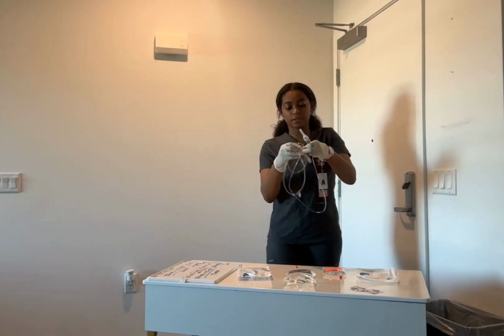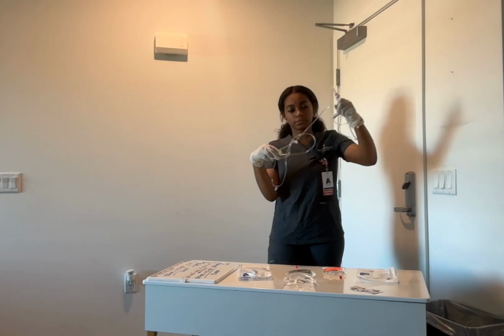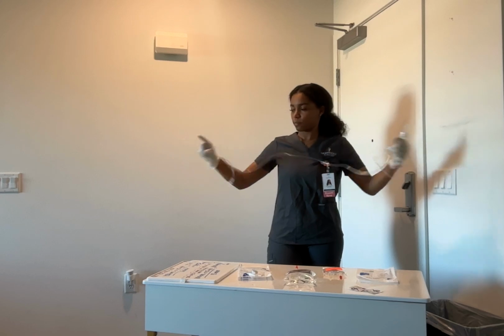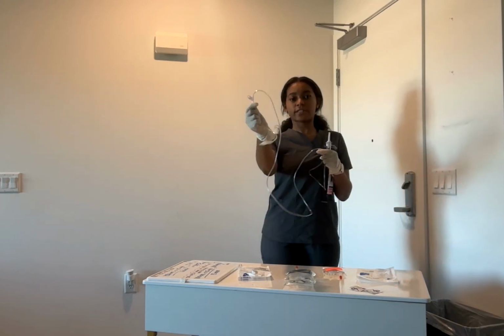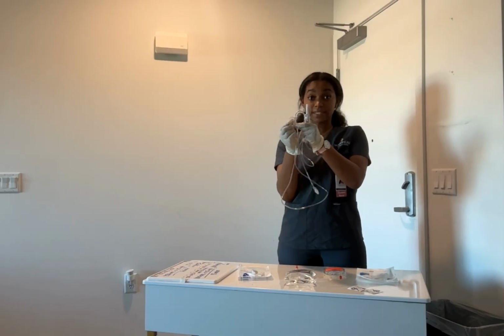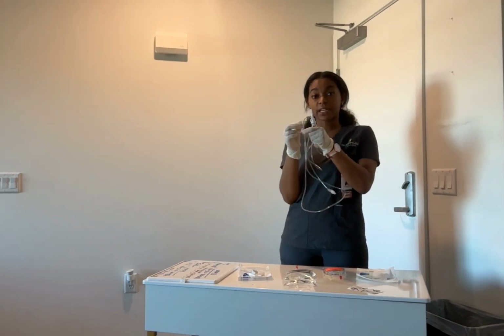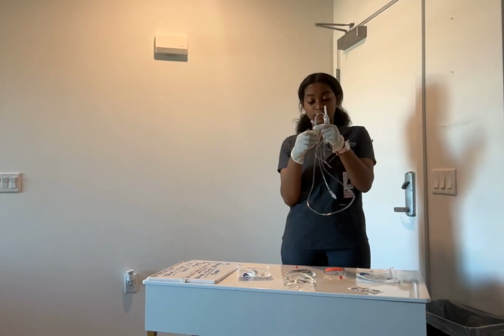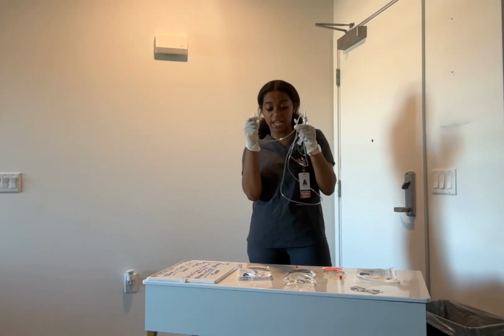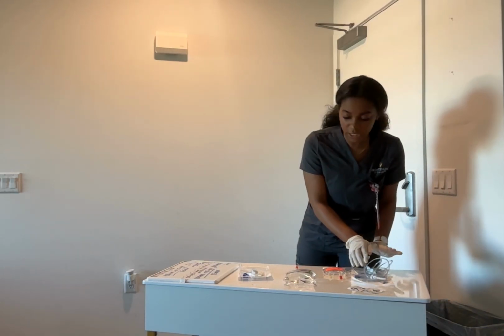And then right here, it's a Y site. So right here, this is where the medication is going to go through from the secondary tube. This is going to be cleaned, and you want to make sure that the medication is compatible so that the tubes are compatible. And then this adapter, this is going to be going to the patient's IV site. So I'm just going to place that right here until we're ready to use it.